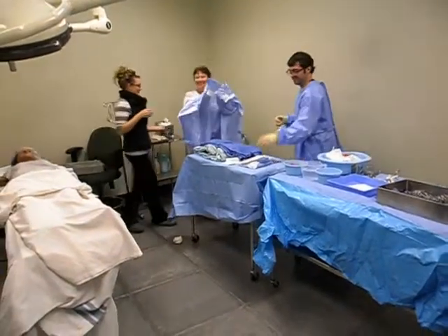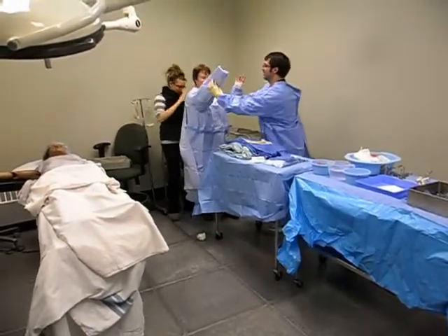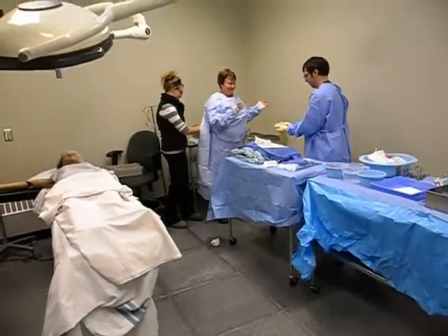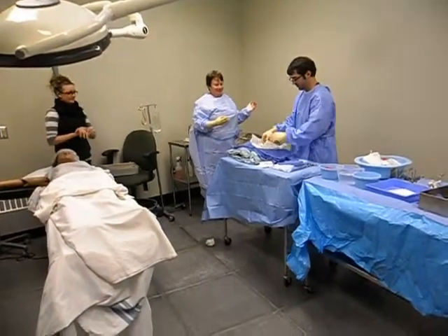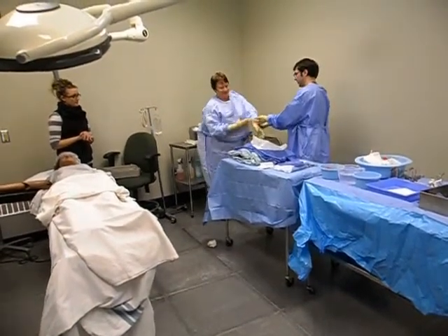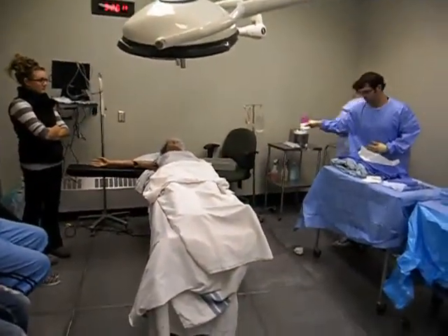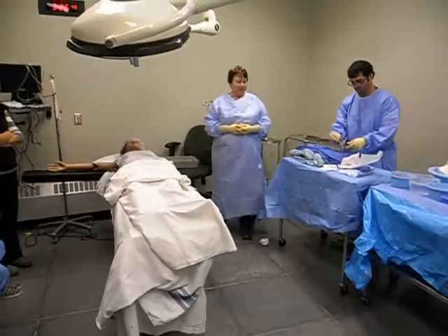All right. And then my other RN comes in to save the day. What hand do you like me to go first? Okay, I like my right, it's on my card. Now, this would not be a good area to do this in, because we are way too close quarters, so we would have to spread things out. All right. So we'll drape.